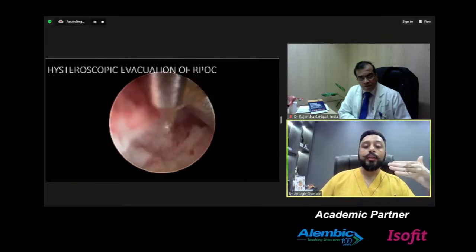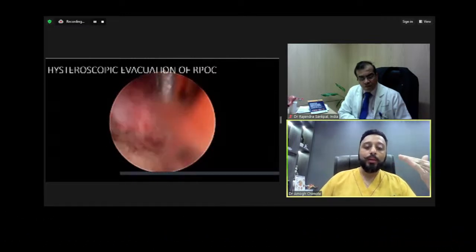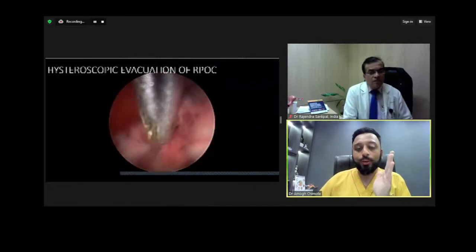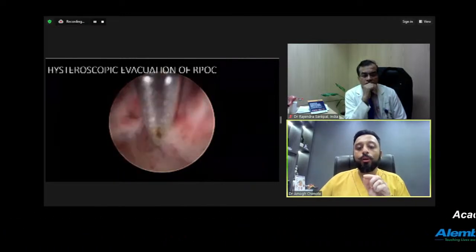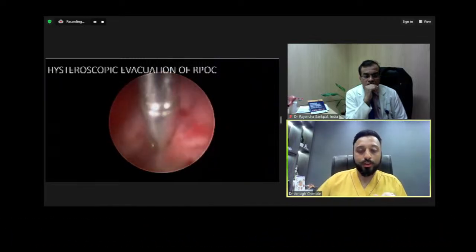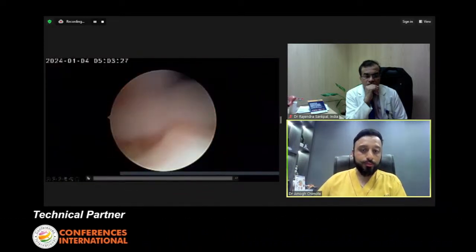Because the damage that can be done by a machine, which can sometimes be uncontrolled in some cases, can be avoided when you use a small mechanical scissor. A scissor of 5 French will cause damage of less than a millimeter. So here you do not have a lot of scope for causing an iatrogenic injury. Even if you want to try and injure, there will be less chance that you injure. So now, as I was saying, yes, there is a place for the resectoscope.